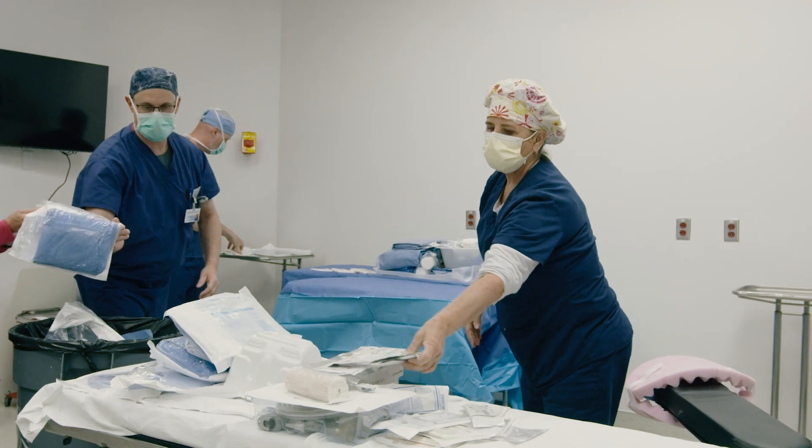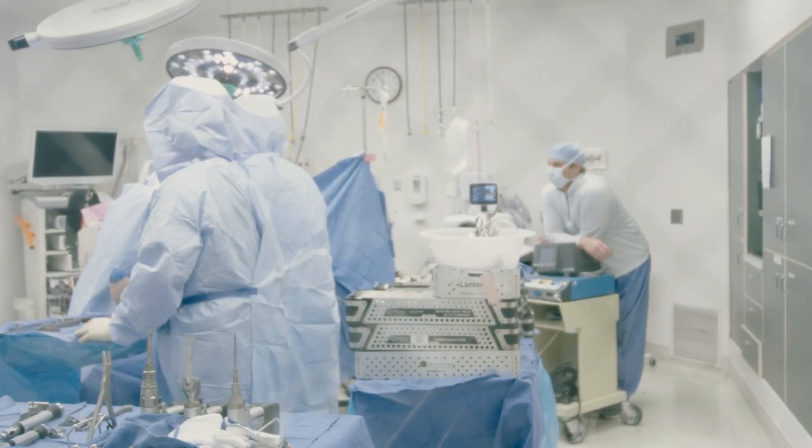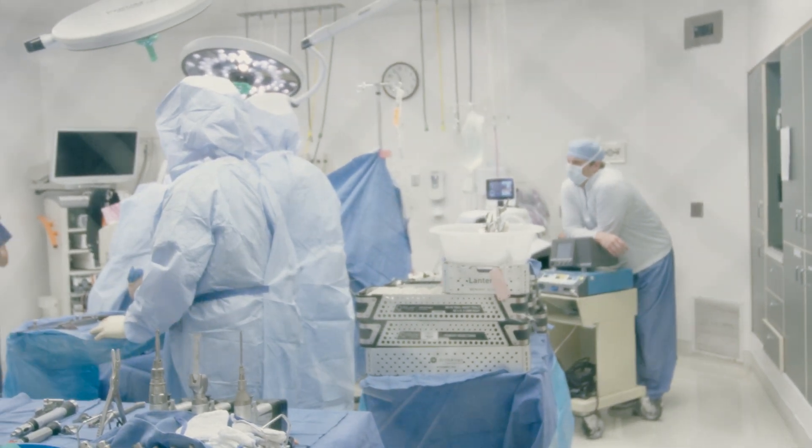I'm Dr. Will Carpenter and I'm an adult reconstruction orthopedic surgeon. I work for Tennessee Orthopedic Alliance, which is a private practice group in Middle Tennessee. Our surgery center here in Nashville, Tennessee currently has six operating rooms. It is generally only orthopedic surgery and we have two rooms carved out for adult reconstruction for hip and knee replacements.